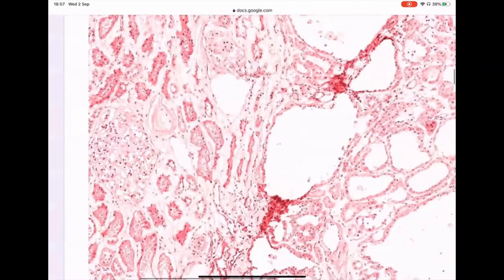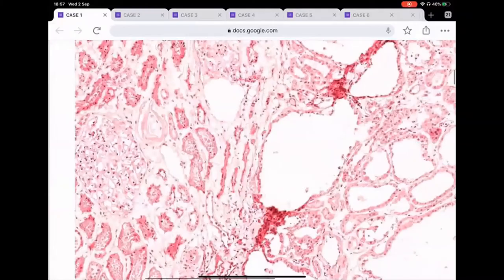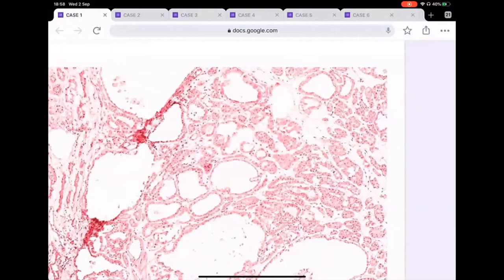I came across one case before where, if you focus on this glomeruli in the corner of the page on a biopsy in a paraffin section, all they can see is tubules, and they saw this part here on that core biopsy. And I saw some of the pathologists did call it maybe renal cell carcinoma. There are some clear cells, but just be aware, if you're not very familiar with this funny look of the glomeruli, that it can look very funny when it's squashed in a biopsy and it is cut thick.